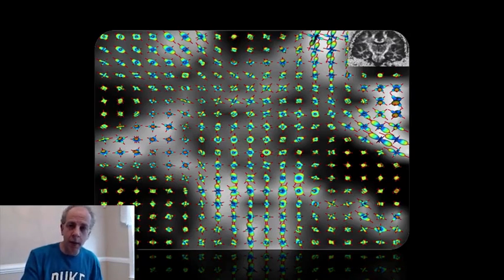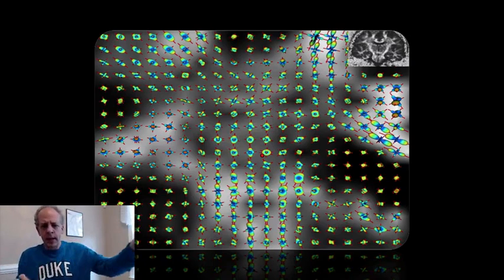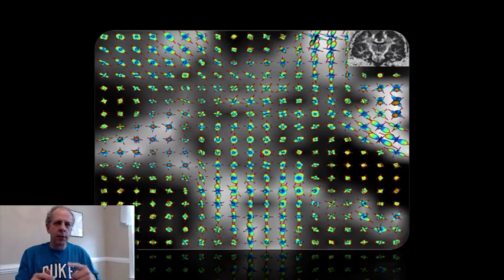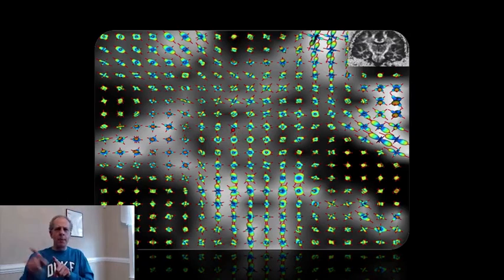And then you can consider the whole. So this I'm drawing here, the more round it is, the more isotropic, uniform the probability is, the more stretched it is, the more anisotropic in that direction. And if you see that there is a cross, then there is anisotropy in more than one direction. You can consider it completely, or as we see here with this red, we can just pick the maxima, where it's actually very strong. And that means that probably there are fibers, there are cables.